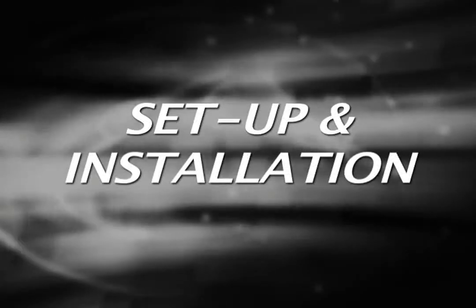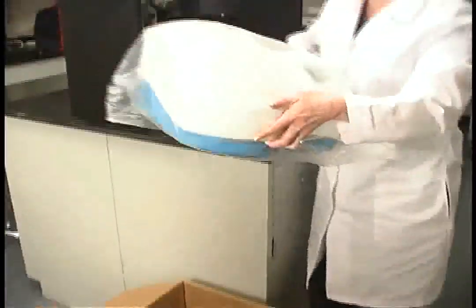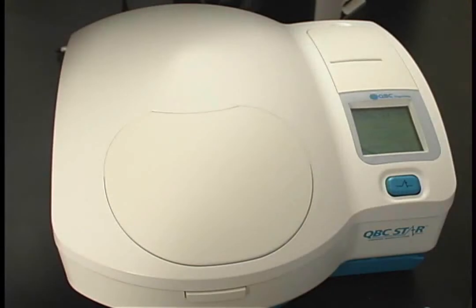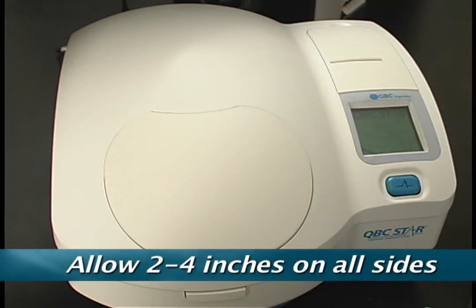Let's begin with the STAR setup. The STAR unit will arrive with everything you need for easy setup and quick use. After unpacking the box, remove the STAR unit from the plastic bag. Place the STAR on a flat, stable working surface. Allow for a 2 to 4 inch clearance on each side of the unit so that it has adequate air flow when running.